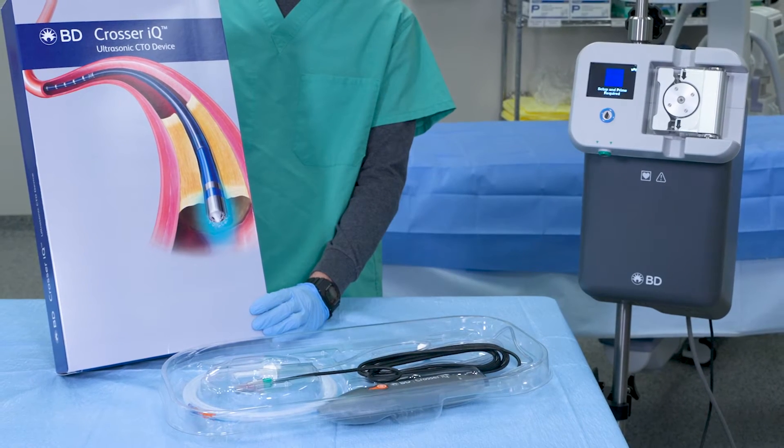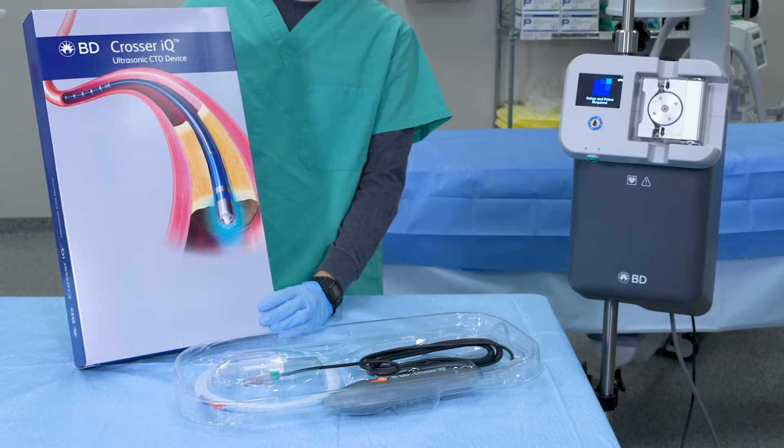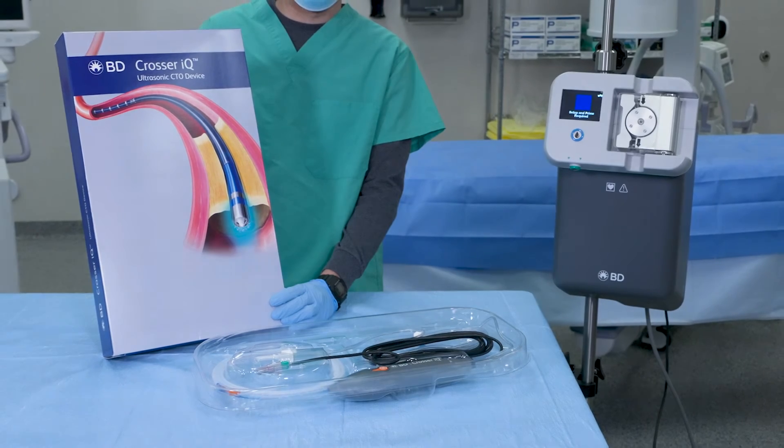Today, we will show you how we've streamlined the setup of the Crosser IQ CTO recanalization system to make this as effortless as possible, all in an average setup time of 2 minutes or less.